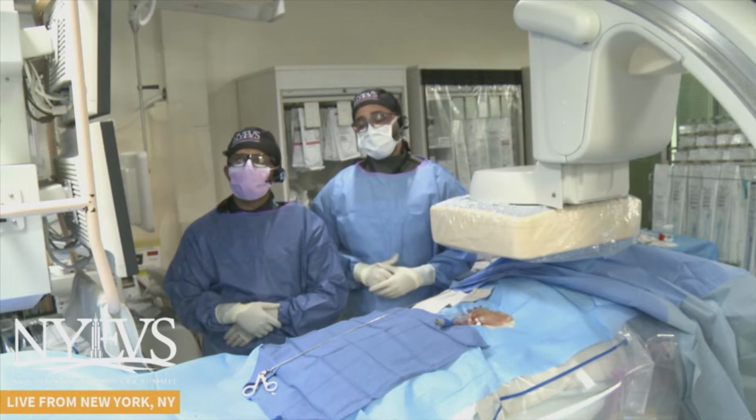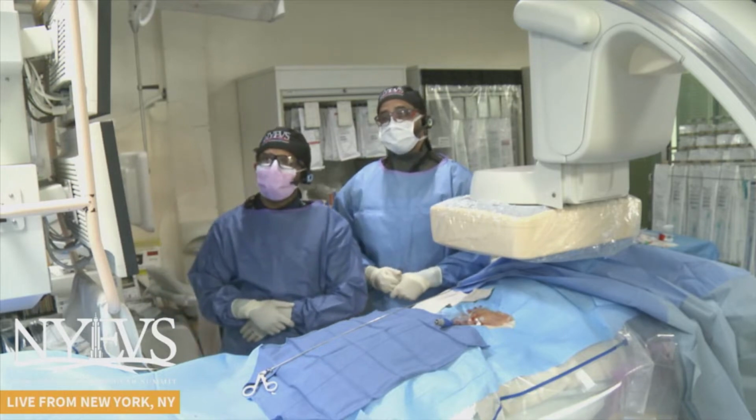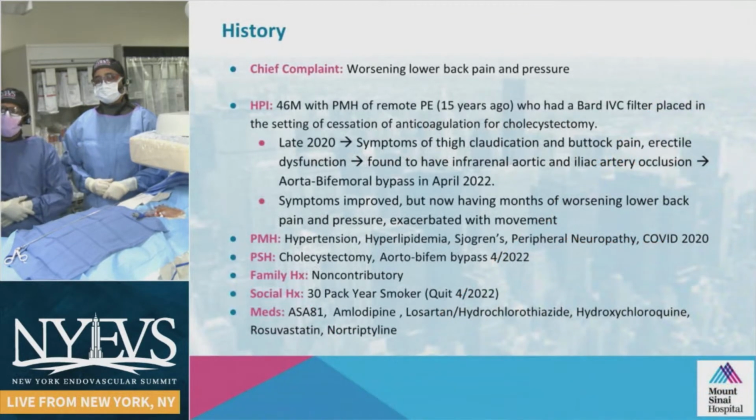So I'm going to introduce Dr. Pasham, who's going to tell you about the case we have today. Ram? Thank you, Dr. Patel. Next slide, please. Today we'll be presenting, as Dr. Patel said, a complex IVC filter retrieval case. It's truly an honor to kick off our first live venous case.